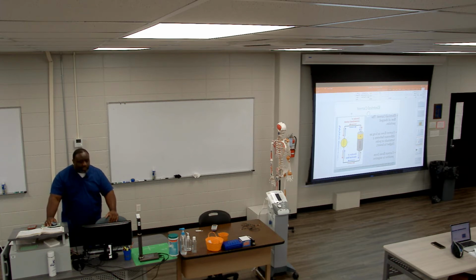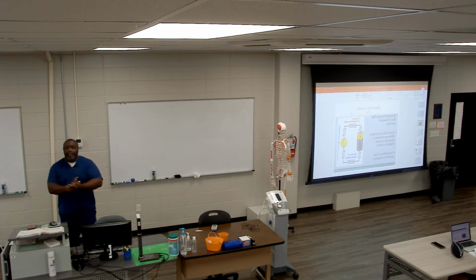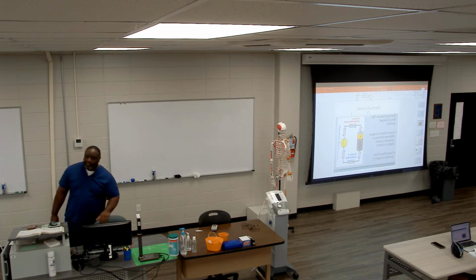For right now, current flows from the positive pole through the device to the negative pole. That's how a circuit is completed. If there is no circuit, there is no flow of current. Okay.